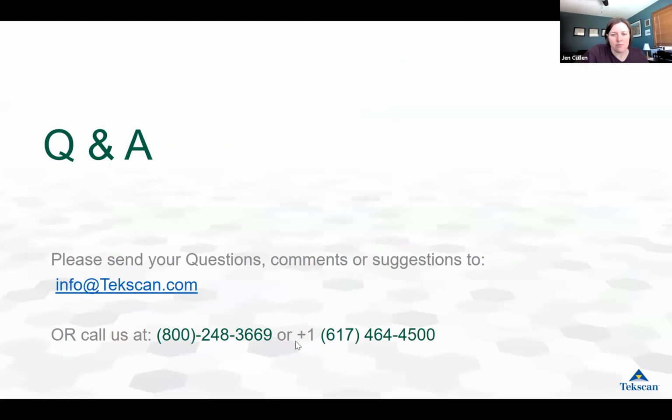So let's just see if we have any other questions here. Someone had asked about obtaining the goal scan for patient education. So absolutely, we will make sure that we get that sent to you. Let me just read this for a second. So the question is, this is a good clinical question that I'll try to answer as much as I can. And then if we need to have a clinician step in, we can too.